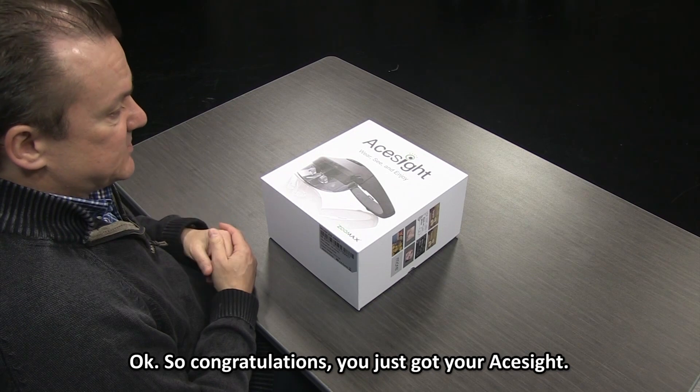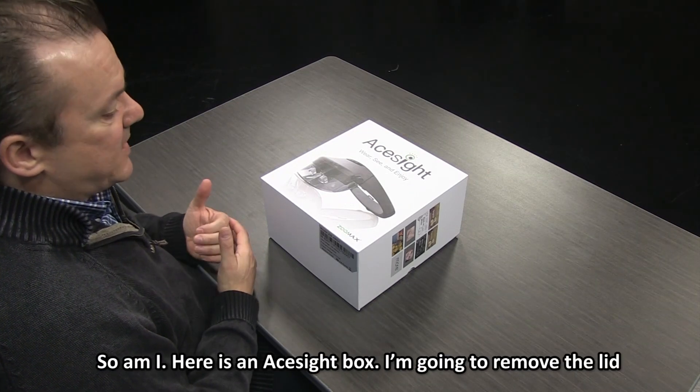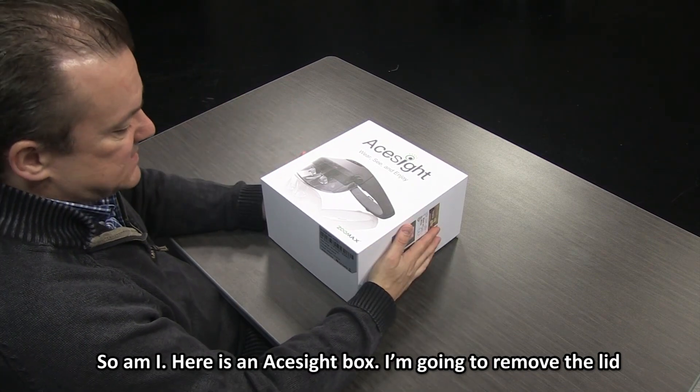Congratulations — you've just got your ACE Sight. You're anxious to get it out of the box, so am I. Here is an ACE Sight box.